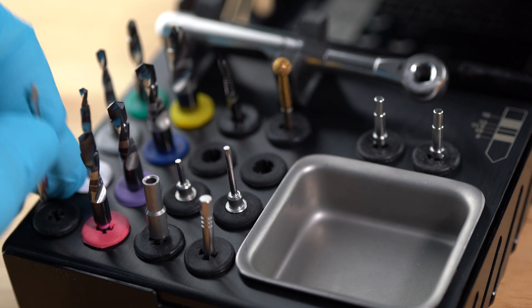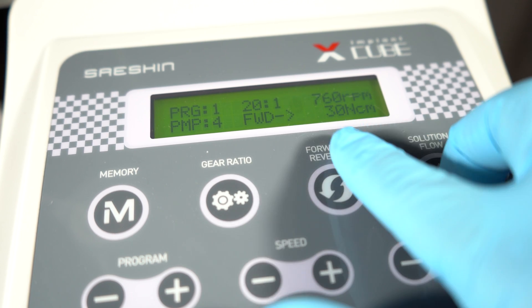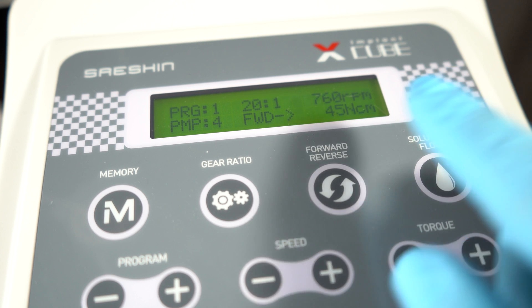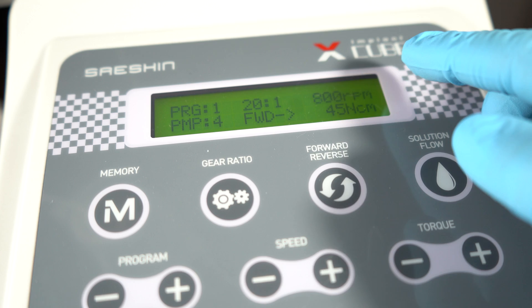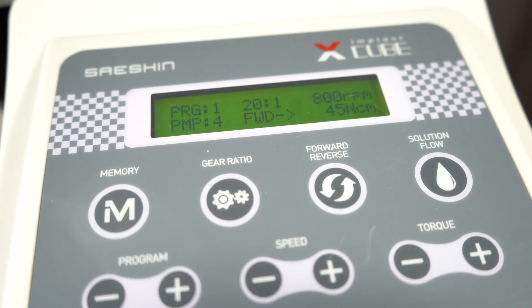We'll be starting with the Lance Pilot drill. Before starting the prep, we're going to change our settings on our motor — torque to 45 Newton centimeters and speed to 800 RPM. Those are the correct settings for our pilot drill.